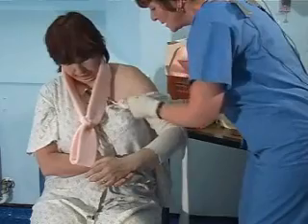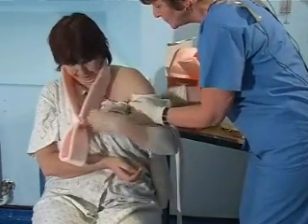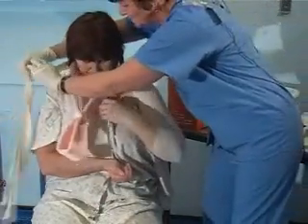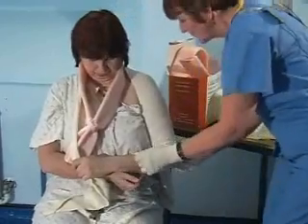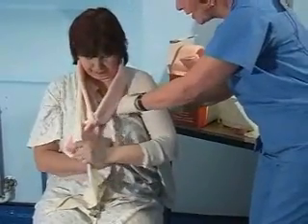The thing you've got to be careful of is that you don't pull the stockinette too tight into the axilla. You can cut that bit, all the way round, and then the patient can hold the stockinette while you make sure that this part is not too tight into the axilla.